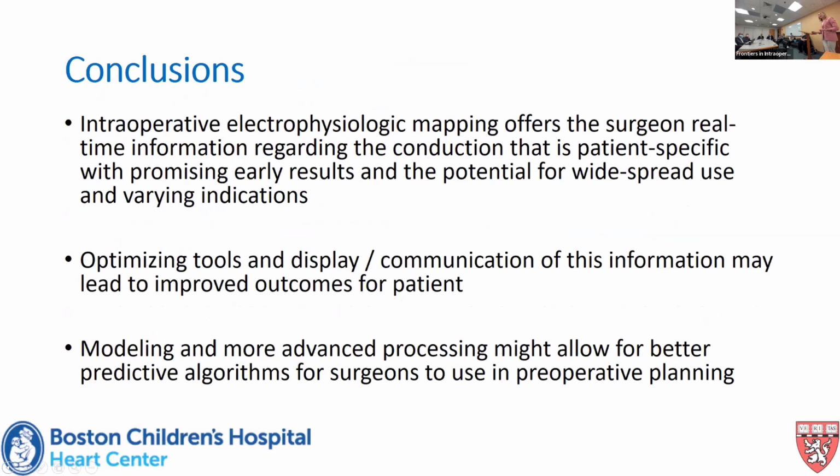So just by way of conclusion, I do think that intraoperative EP mapping has a future within congenital heart surgery. I'm obviously a little bit biased, but I think that we have the possibility of providing functional data about where the His bundle is located and where it's activating. And we have some promising early results, definitely still work to be done. I also think it will integrate or potentially integrate with other forms of identification that we're talking about today, like the histological approach, that perhaps you first start by honing in on the area, by finding the electrical signal, and then perform the more detailed confocal microscopy or mapping to really map it out when the heart is arrested.